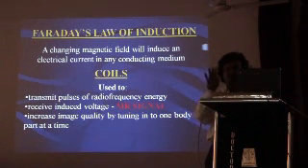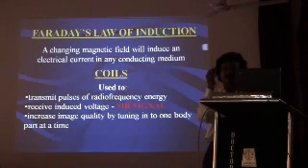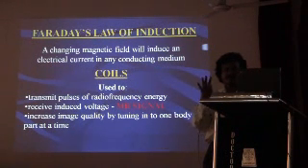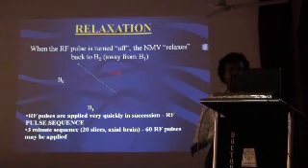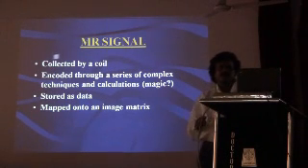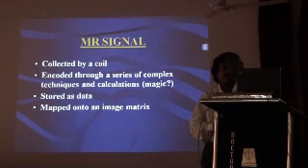These coils are nothing but they throw a radio frequency pulse as well as receive the radio frequency pulse. Okay? Now as far as relaxation is concerned, there are 2 types of relaxation. One is transverse relaxation, one is longitudinal relaxation. You don't have to remember.